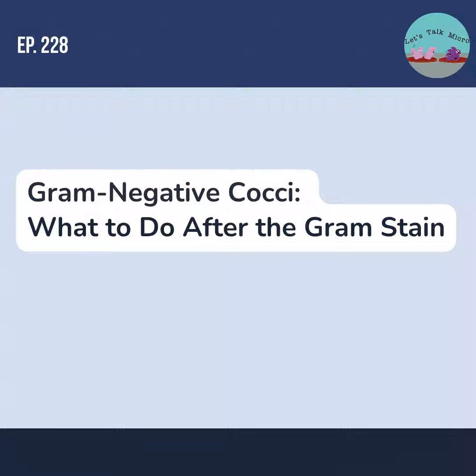Things like long thin rods for Lactobacillus or hockey puck for Moraxella catarrhalis. So you might hear something called JEMBEC on your test. You might have a question about that, so let's go ahead and talk about this.